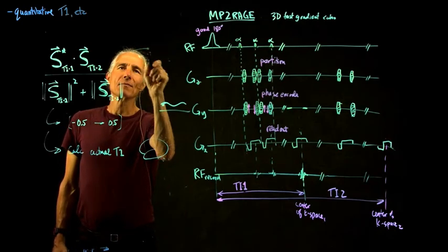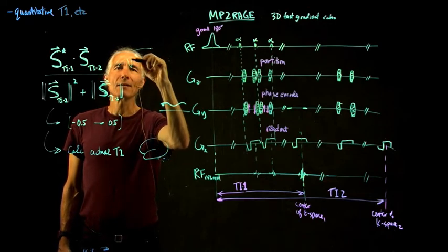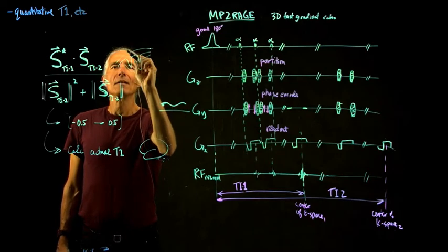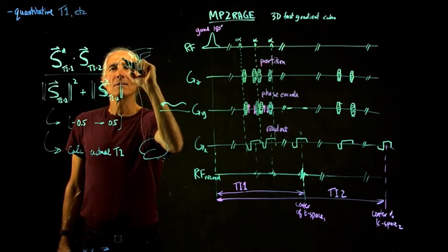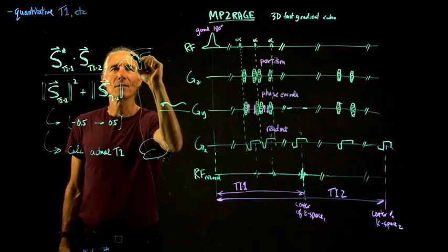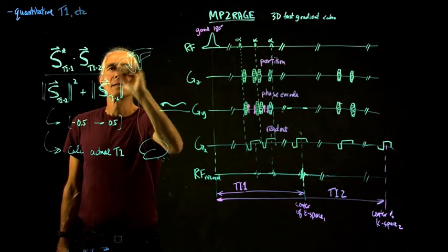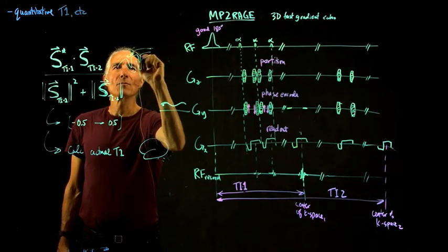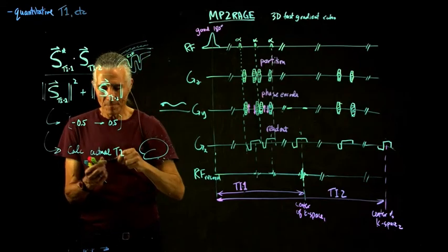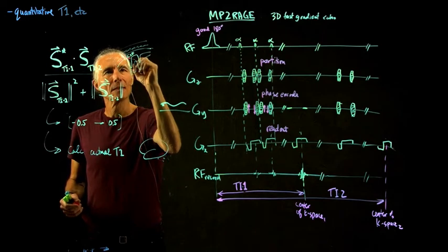So if we look, here's the brain in here, and you've got the CSF, which is dark. The CSF will look like noise. It won't look black. Then you've got some marrow of the bone, which will look correct, but the CSF will be all speckly.